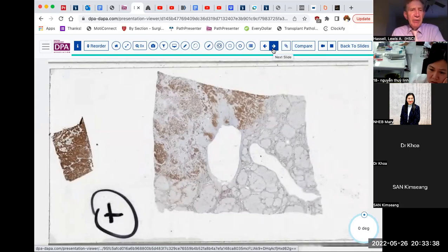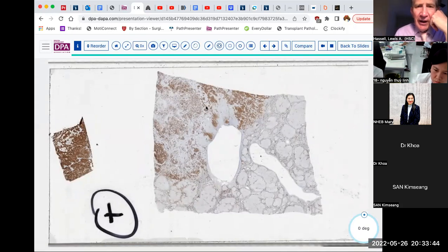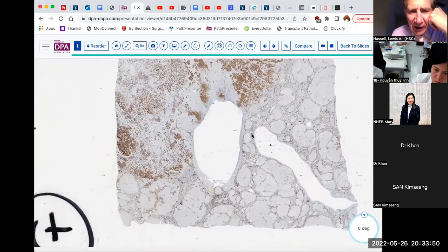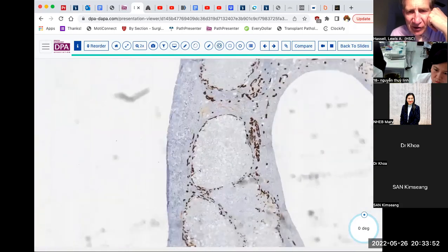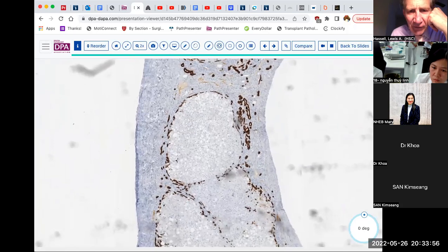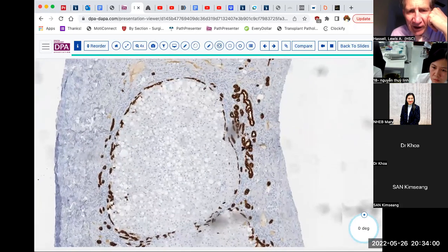So we've mentioned immunohistochemistry can be useful in these circumstances. I haven't given you exactly what the staining components are here, but I think perhaps you'll be able to surmise, by the fact that as we look at the cirrhotic liver these are all staining strikingly positive. These are the bile ducts.